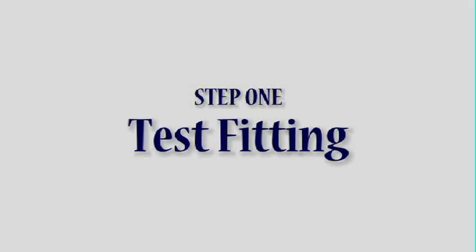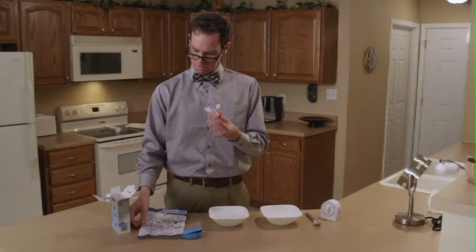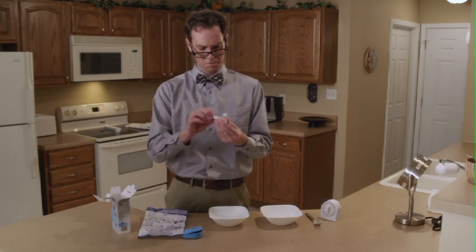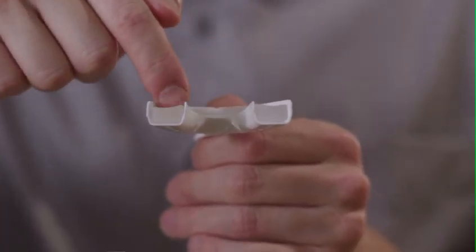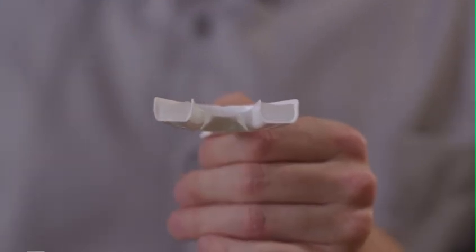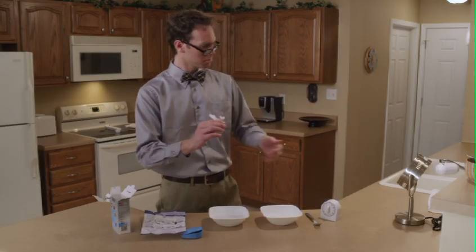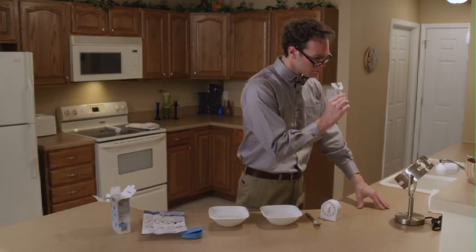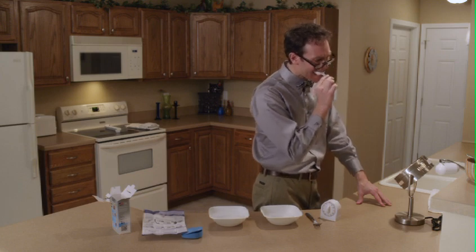Step 1: Test Fitting. The SleepEasy Dental Guard is preloaded into the custom comfort forming tray. The Dental Guard is positioned correctly when the top of the Dental Guard is concave. If it is not in the right position, correct the placement before going any further. Start by placing the Dental Guard and forming tray below your upper teeth and bite down, looking in a mirror to ensure the tray is centered in the middle of your front two teeth. Your teeth should be aligned in the middle of the moldable material.